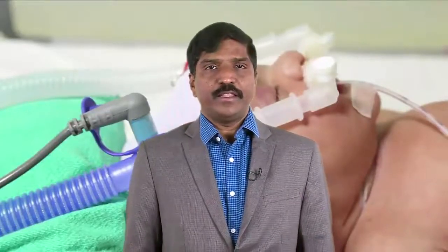In this webinar, we will learn the essentials and initiation of bubble CPAP in a newborn. Delivery of CPAP to a newborn includes delivery of continuous positive airway pressure to the airway and lungs, delivery of an air and oxygen mixture at the preset fractional oxygen concentration, and delivery of the air-oxygen mixture at body temperature and at a relative humidity of 100% to the newborn.